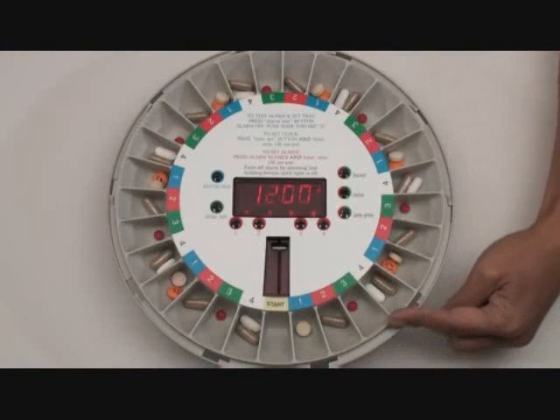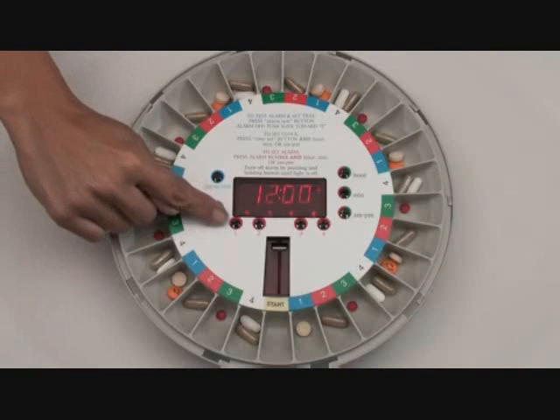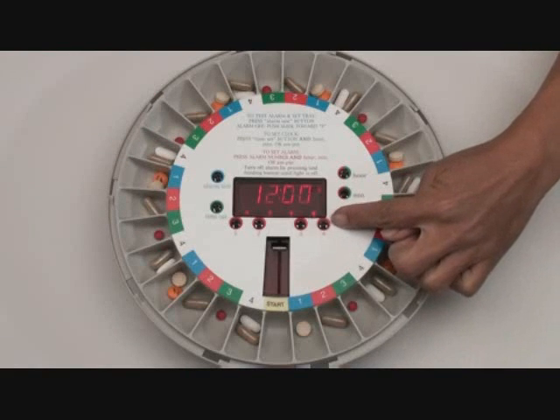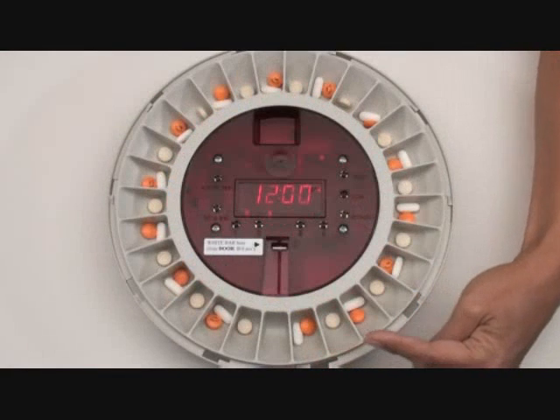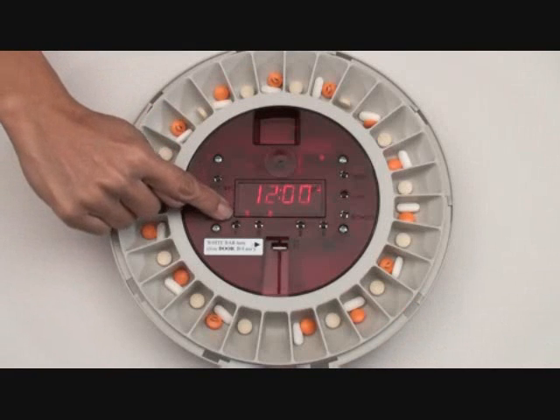Load the medication tray using our easy-to-use templates. In this example, it's four times a day, and then set the four alarms. For two doses per day, simply load the tray by twos accordingly and then set the two alarms.